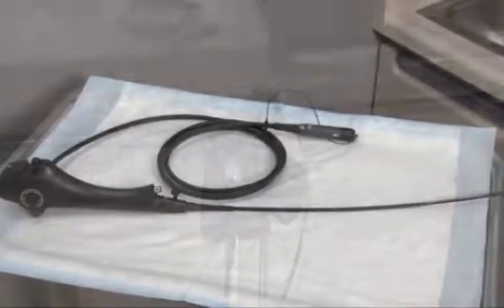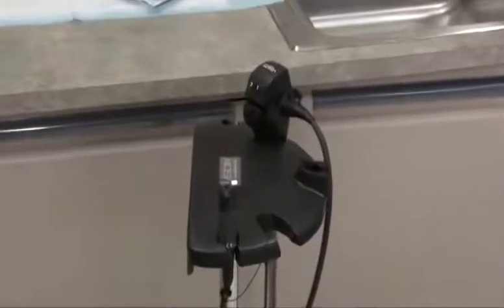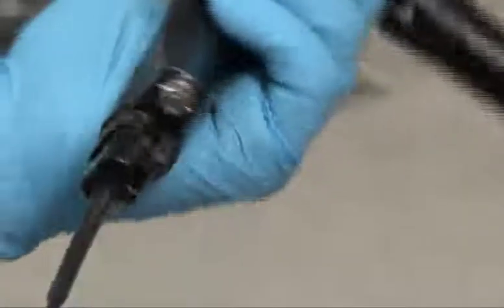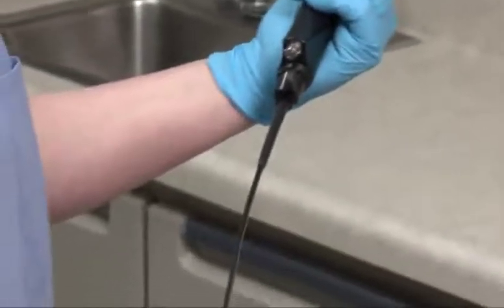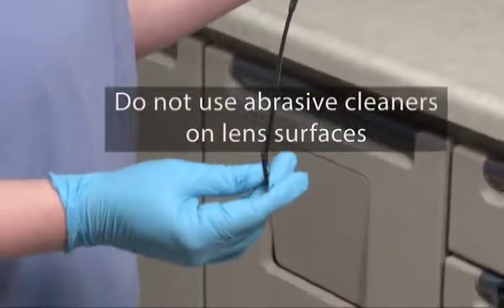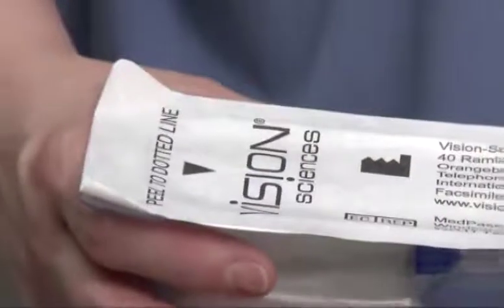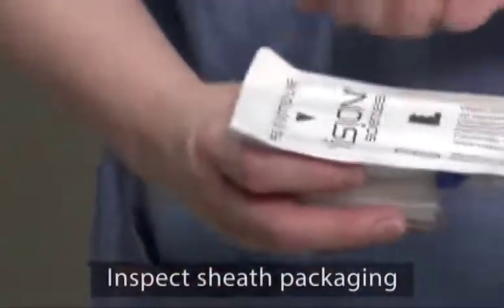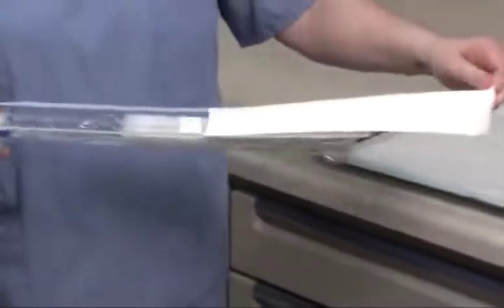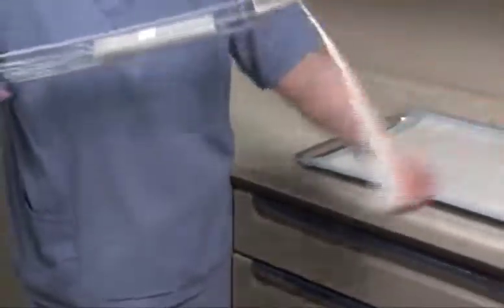In addition to the endoscope and disposable sheath, an installation stand is required for proper system preparation. Before installing the sheath, check the cystoscope insertion tube for any defects or damage. Do not use abrasive cleaners on the lens surfaces. Check the Endosheath disposable packaging for defects or damage, then open the outer package for the sterile sheath and open the sheath's package carefully.